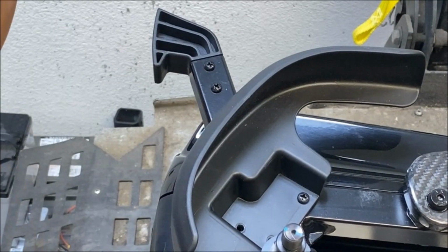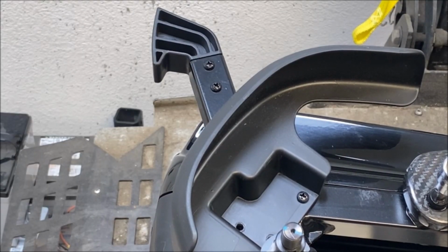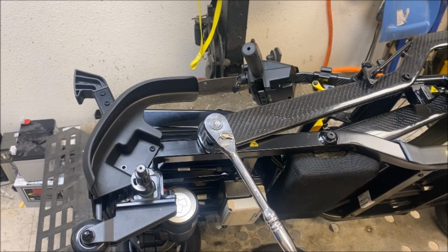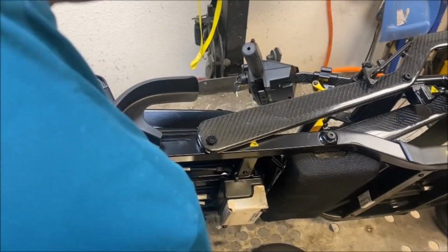Work smarter, not harder. Alright, so let's see. Probably going to be 4mm. So they're going to be 4 or 5. 4. Oh, I got pulled away on a job, so it's the next day. So yeah, 4mm will remove that portion there.